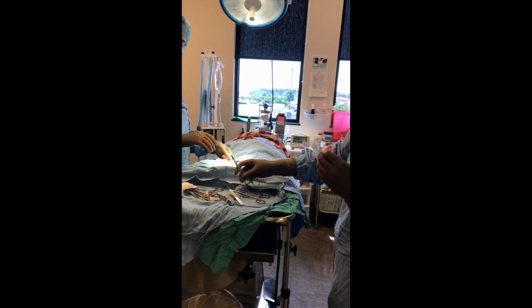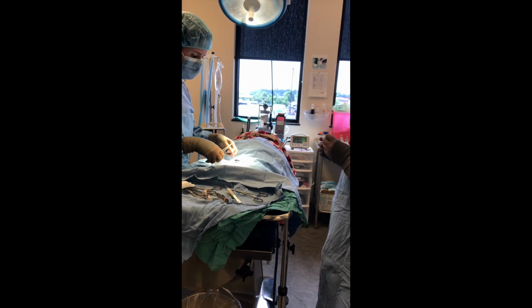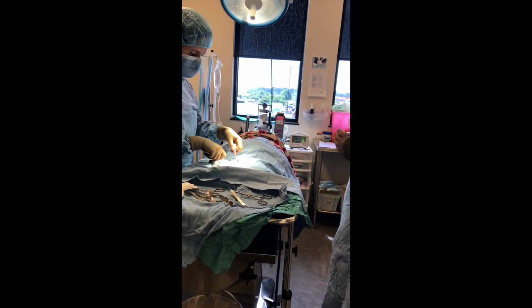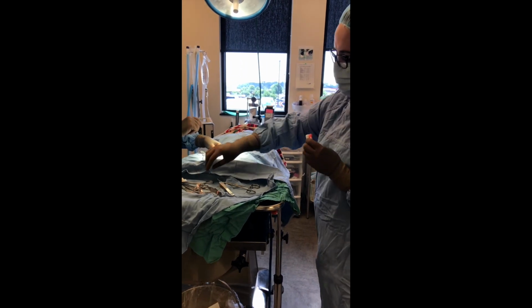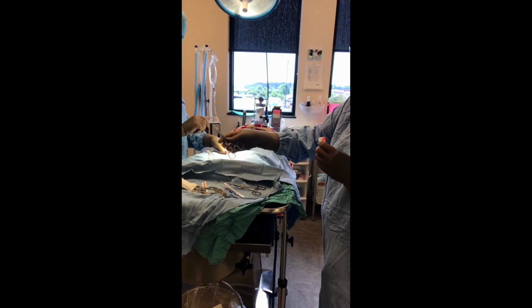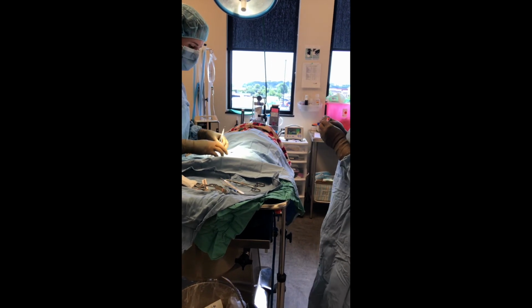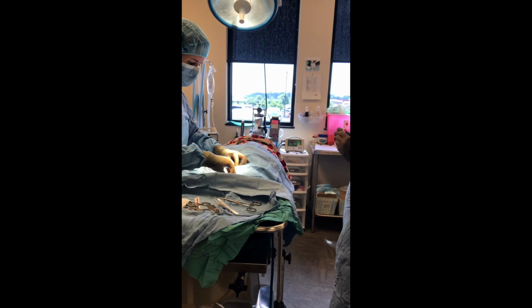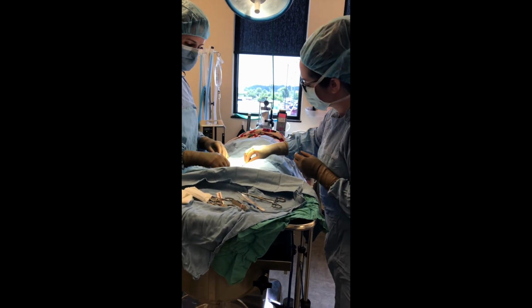Curved okay? Curved is perfect. Thank you. And one more set. Beautiful. Don't mind blotting a little bit right there.